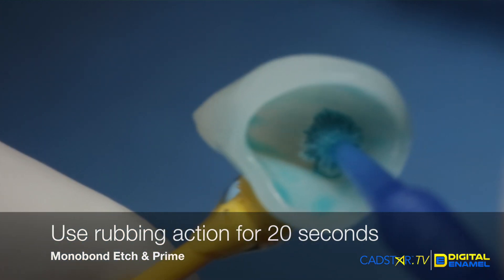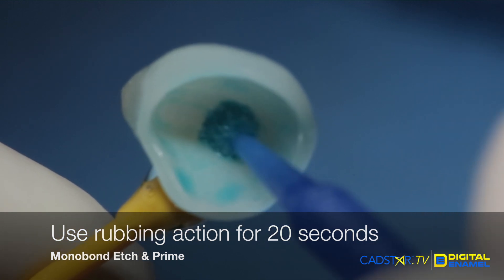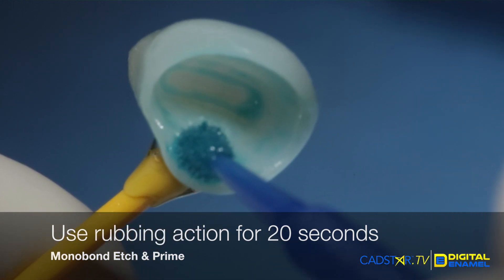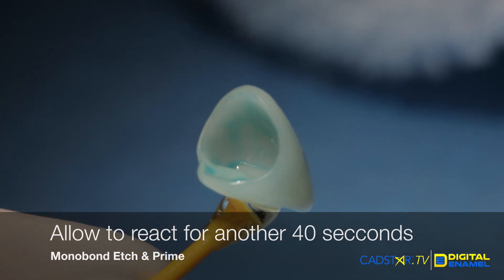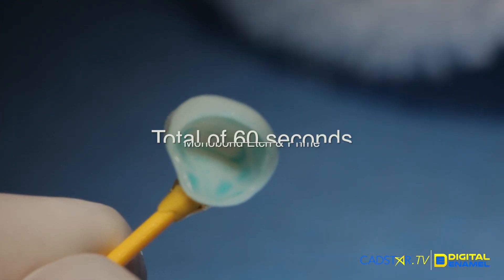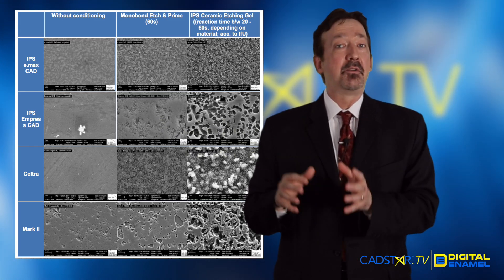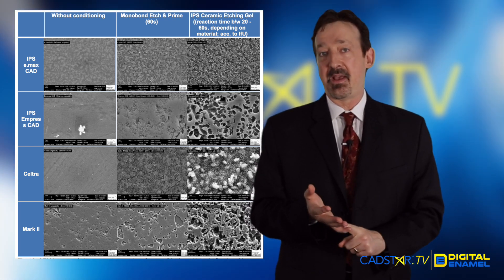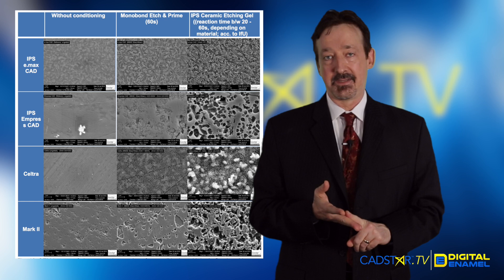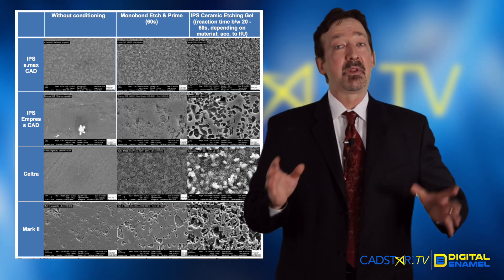Here are the rules when using this. The first 20 seconds, you want to rub on the etch and primer — so you're going to rub for 20 seconds. After 20 seconds, you'll let the etch and primer dwell for 40 more seconds, so the total is 60 seconds. This applies to all different types of ceramics, whether it be feldspathic, IPS Empress, or e.max. It's the same time period. This system is really forgiving.